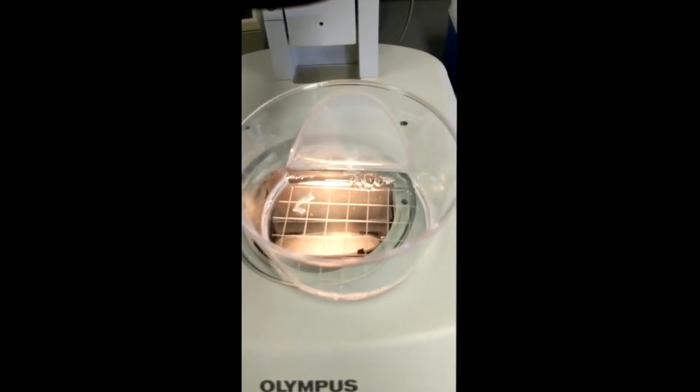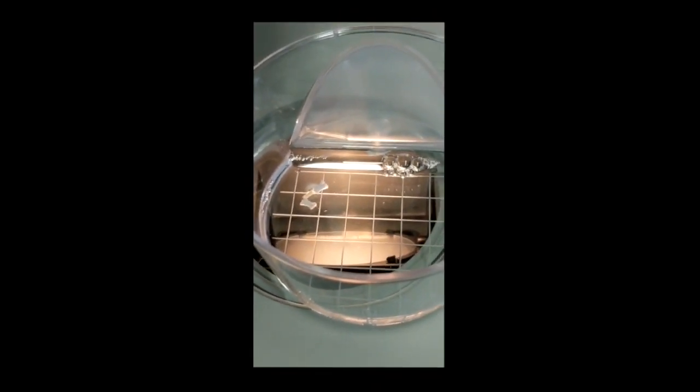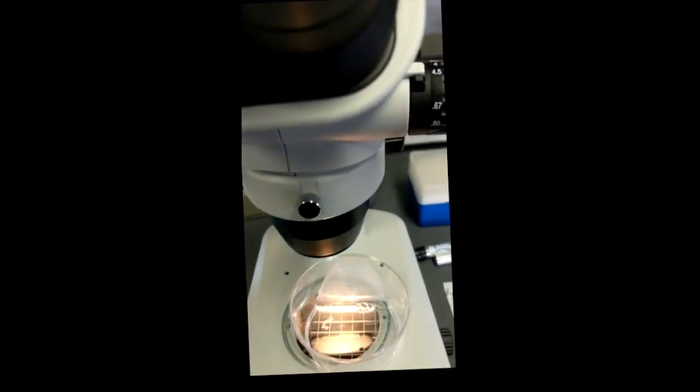Here we have another example where the embryo popped up. And now, found the embryo.